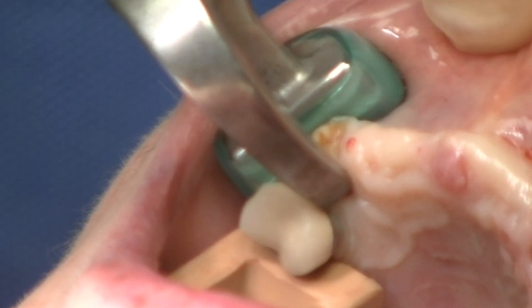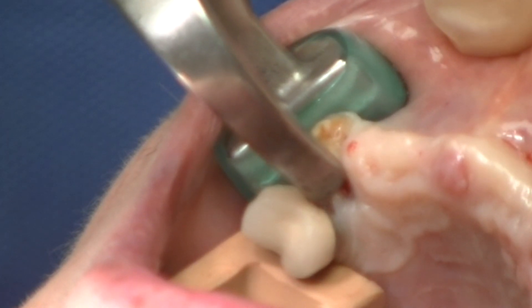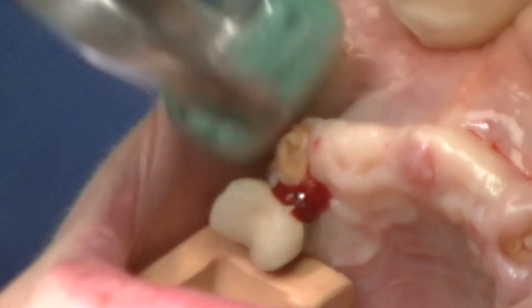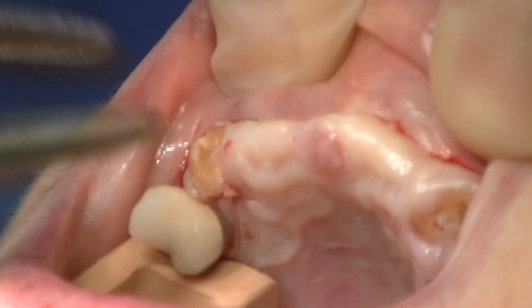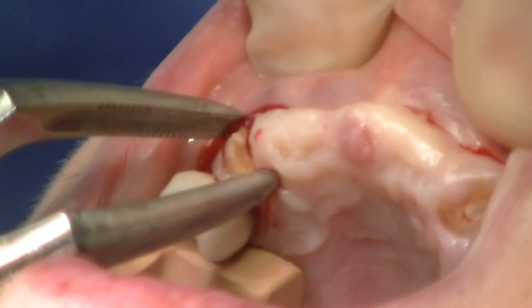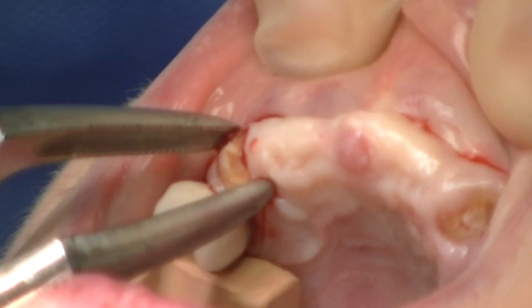There is no squeezing of the instrument, and in a matter of a few seconds, you will see the tooth will pop. You may not actually hear a pop, but you will see the tooth luxate up and out of the socket, actually maintaining that facial plate of bone quite effectively. Remember, you cannot remove the tooth with a lot of hand pressure. It is truly not a forcep in that respect.